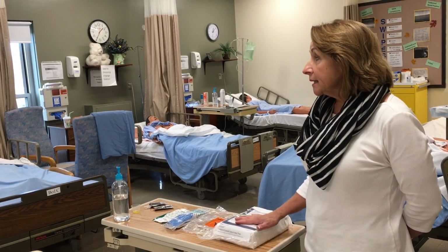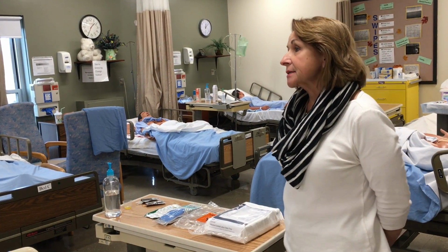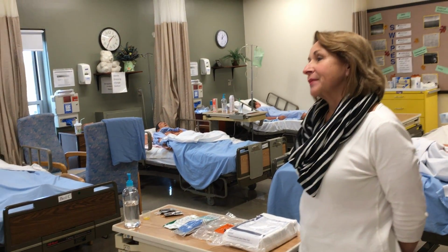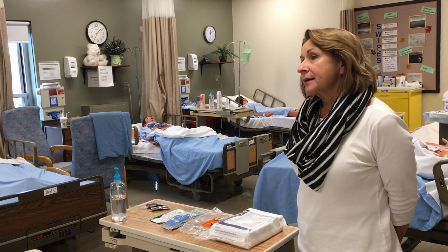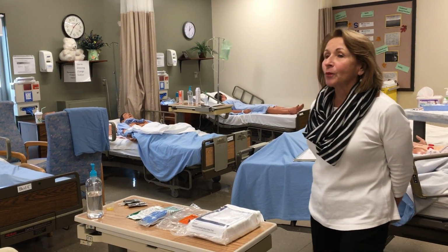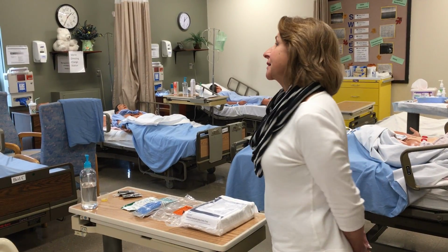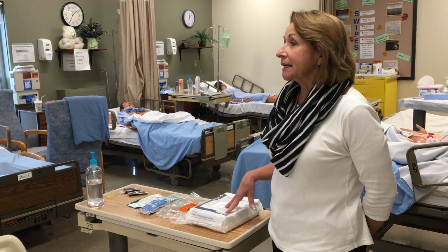Now, if you do an indwelling Foley catheterization, there's two types. What are the two types? Double, triple? Nope, that's the differences in the catheters. Two types of insertions. Male and female. Good guess, but no, that is wrong. Open and closed. What's the difference between open and closed? Anybody?